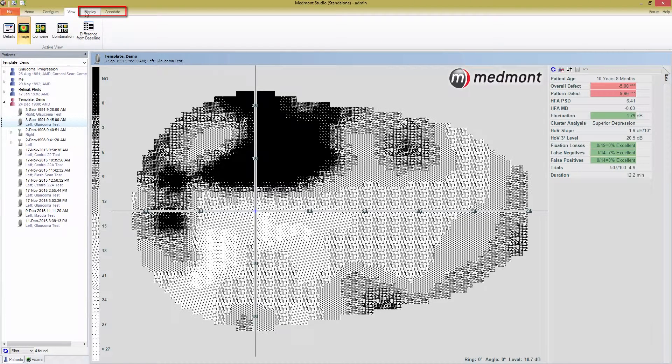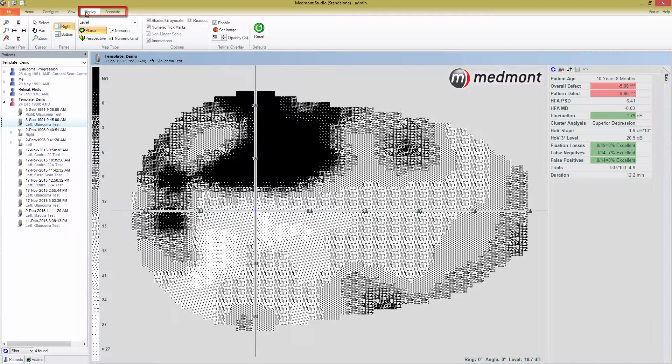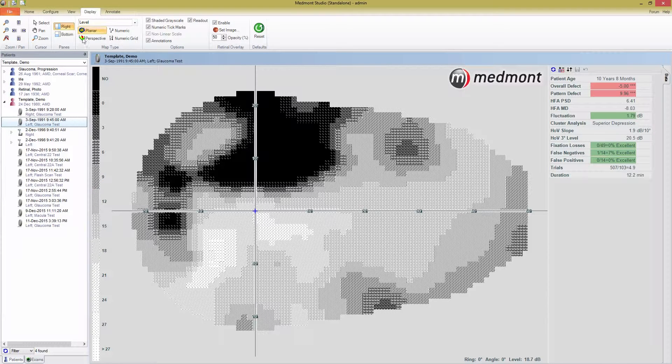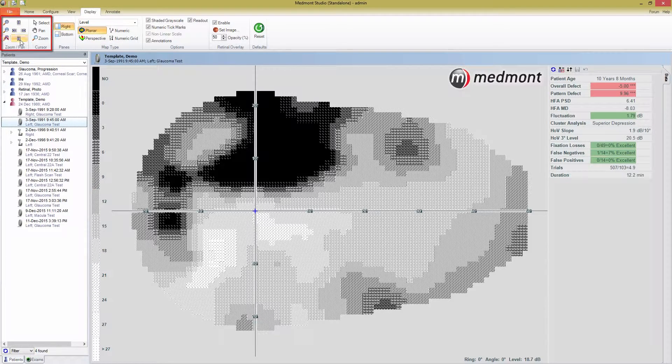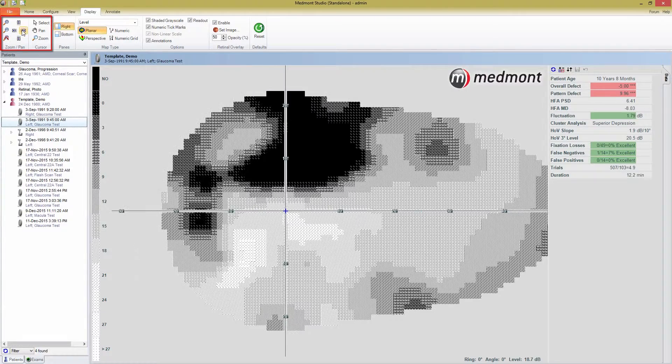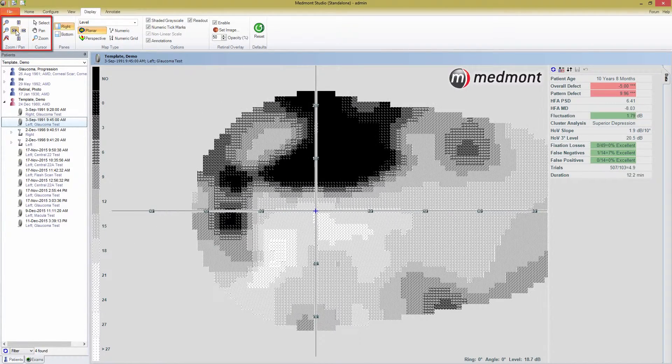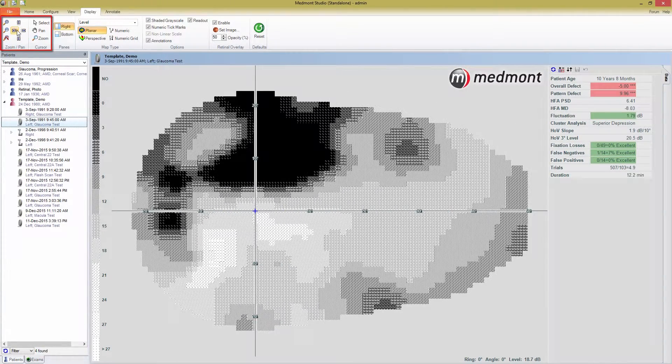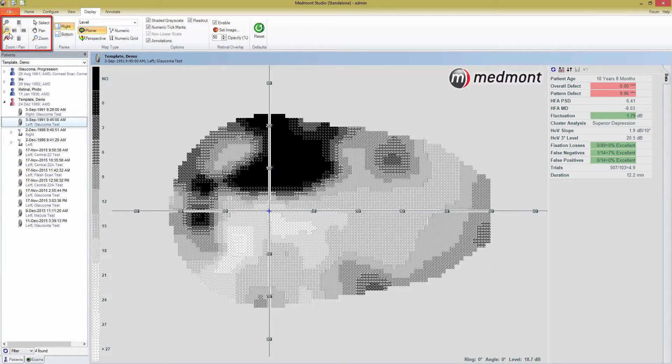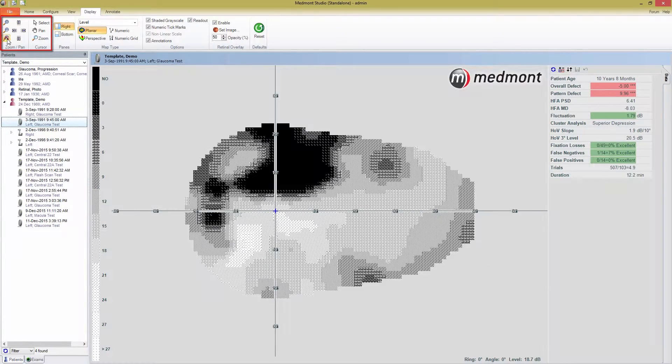The Display tab is the main window for changing the way your results are displayed. In the top left of the toolbar are the zoom, pan, and cursor sections. These are primarily used to examine topography in DV2000 exams, but you can play around with them to move the map around or find out more in the user manual.